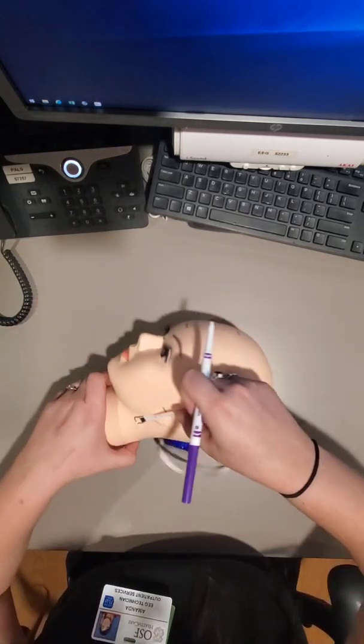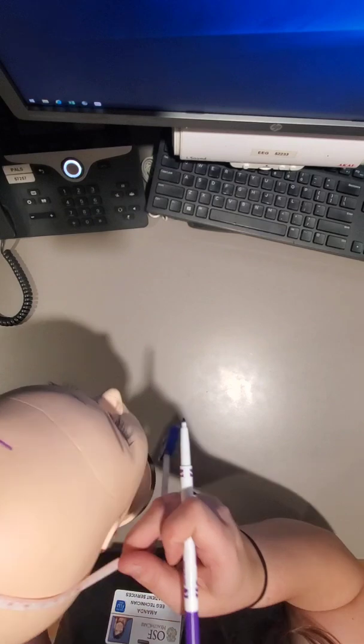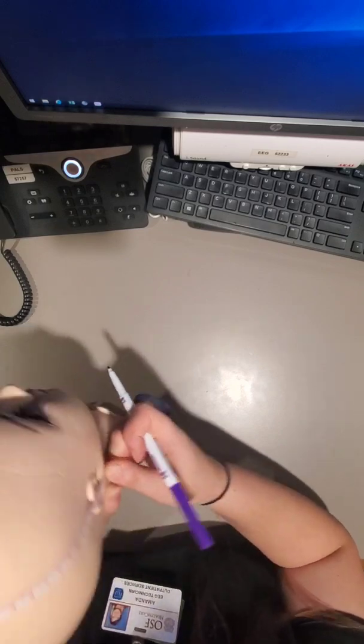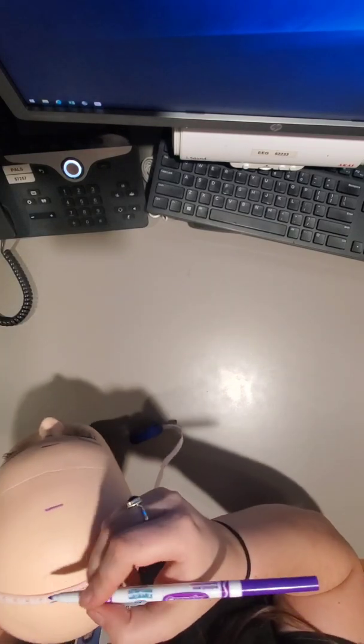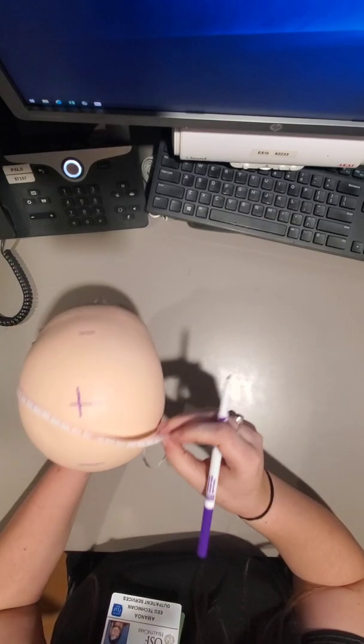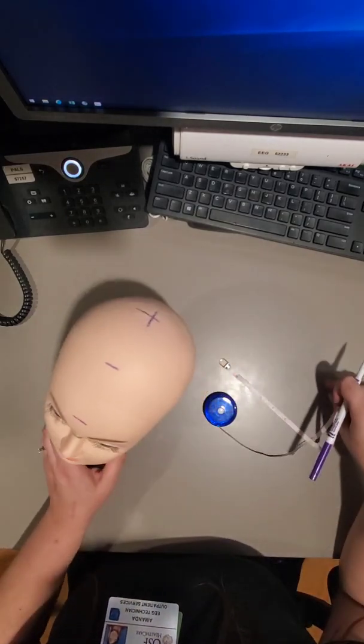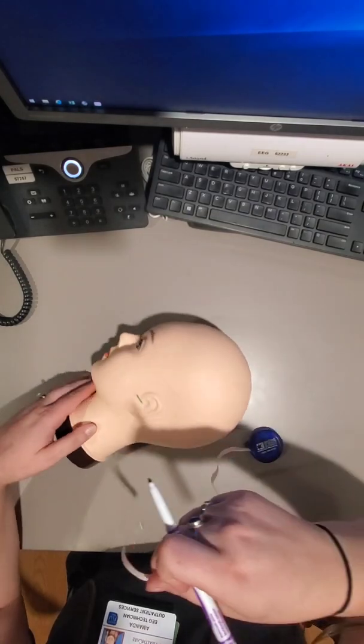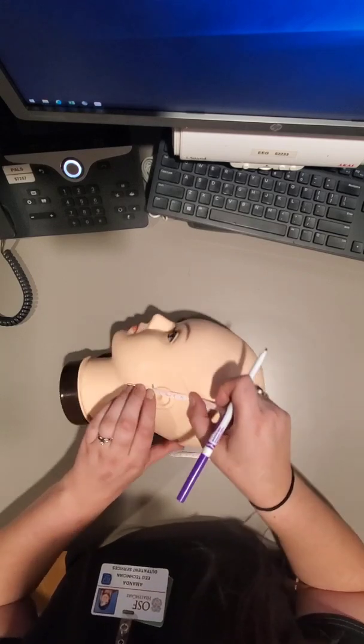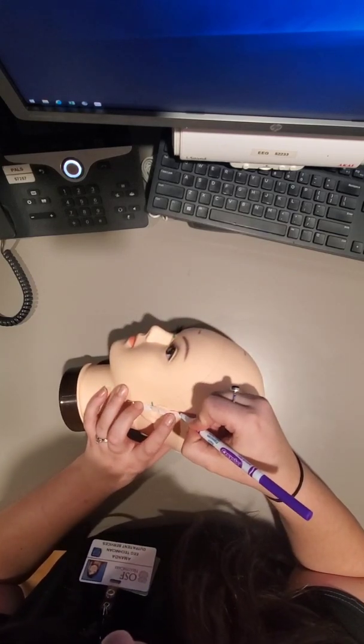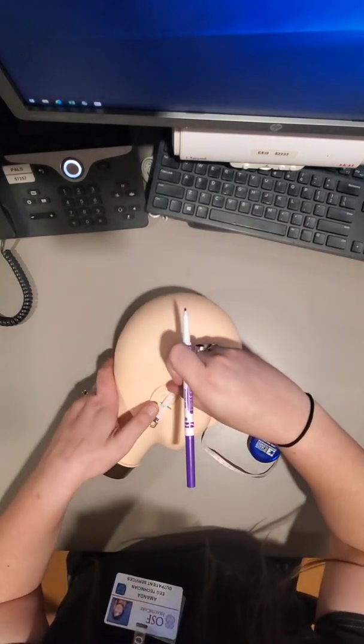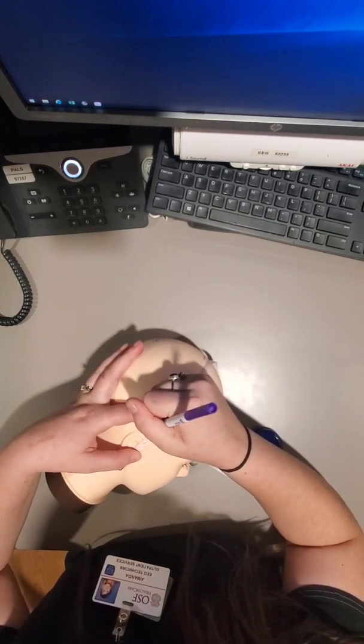I'm going to measure the left pre-auricular point through CZ to the right pre-auricular point. 36.5 divided by 2, that's 18.3. So I'll cross my CZ measurement. And then I'll do 10% of 36.5, 3.7. And then the same over here on the right pre-auricular point, 3.7.